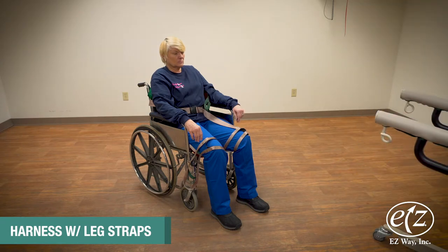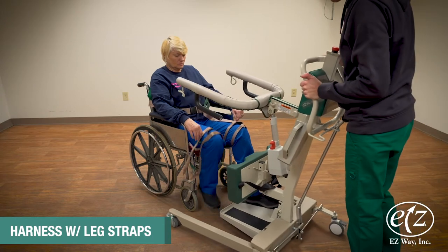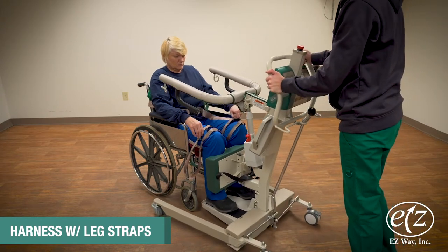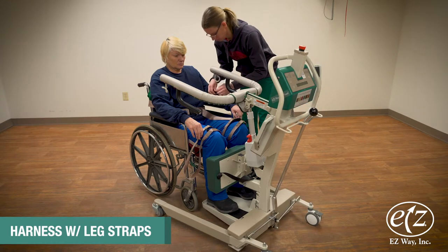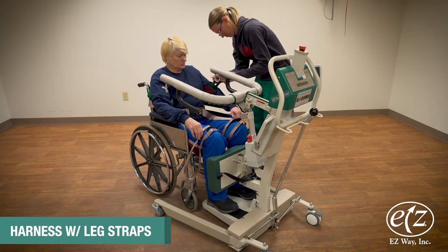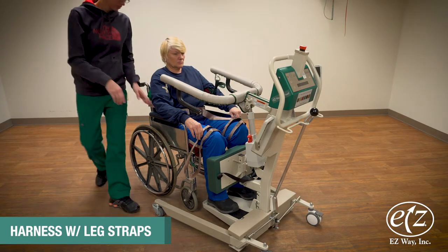Bring the easy stand to the resident or patient. Hook up the harness using the loops on each side of the harness to the hooks at the end of the easy stand arms.